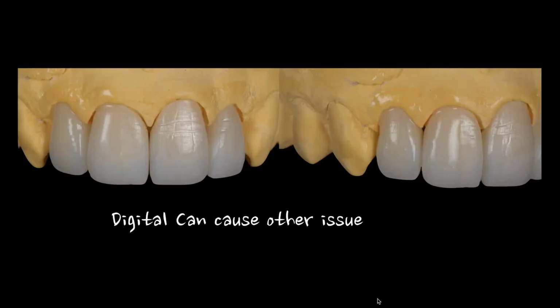Last point I make before I finish up with the case is back to the digital world. Another issue that we developed in the digital world is this. We're trying to put our surface topography in the monolithic lithium disilicate or in the zirconia materials, and it's really hard to do, right? So I ground on these afterward just to show you. Really hard to get these to look smooth and free.